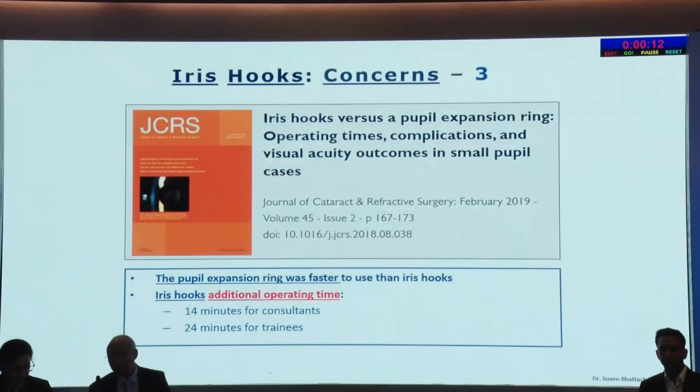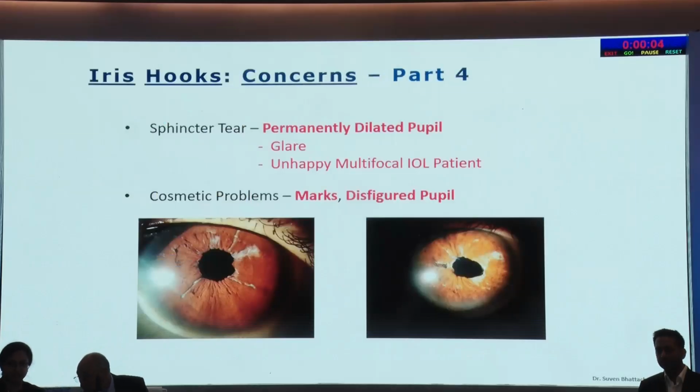It can be a little bit of touch and go. This is a published study where it says that the iris hooks take more time. Maybe in Indian scenarios, probably less time. You never know. And it can leave marks.